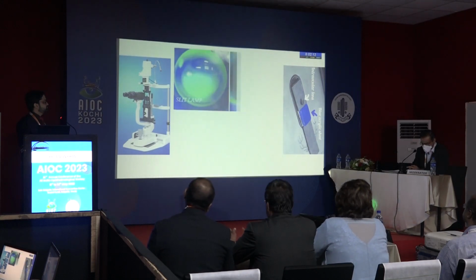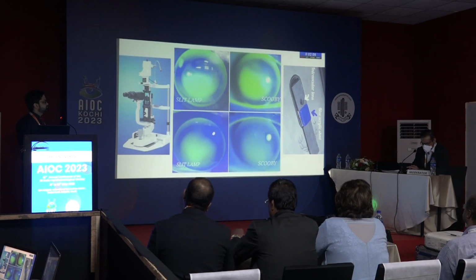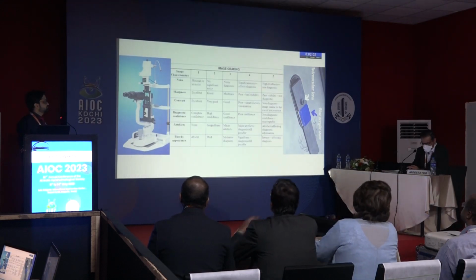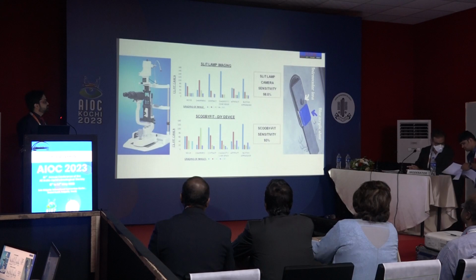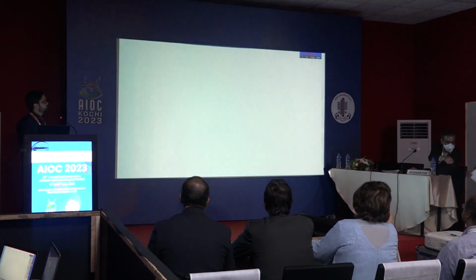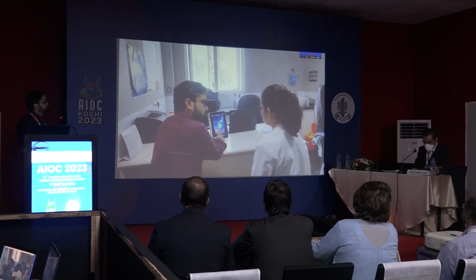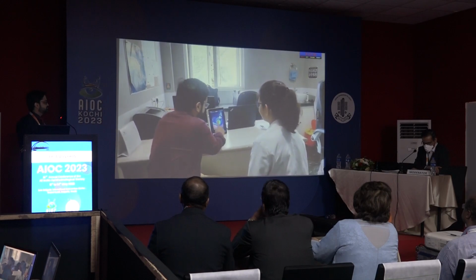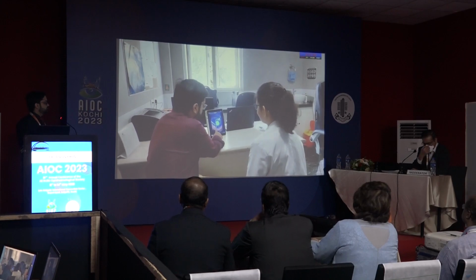The images obtained from both the slit lamp and the do-it-yourself device were randomized and transferred to an iPad, and an independent examiner was asked to diagnose and grade image quality of each image based on the following grading system. We found that the image quality and diagnosis of contact lens fit was comparable between the two photographic devices. We found this device particularly useful as a teaching tool where recorded videos and pictures could be simultaneously viewed by the teacher and optometry or ophthalmology students and discussed.